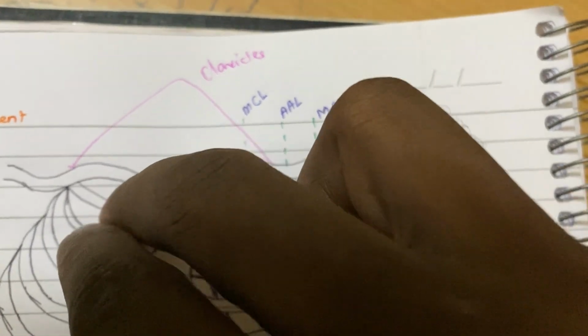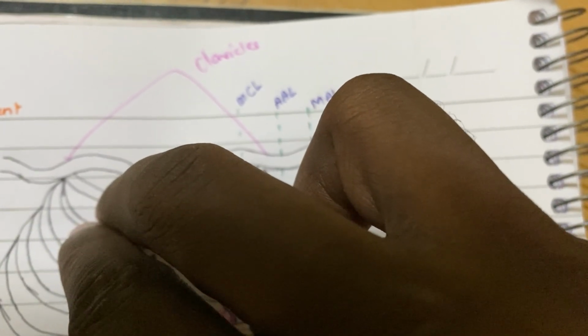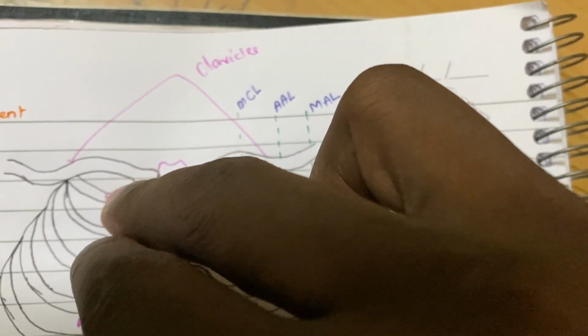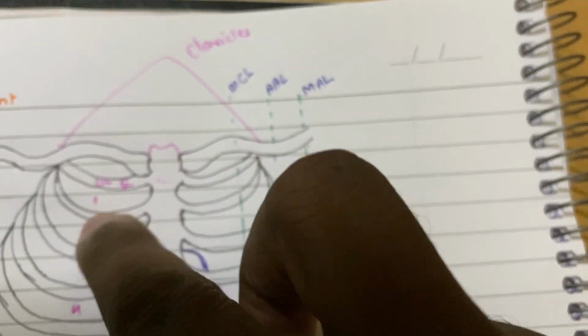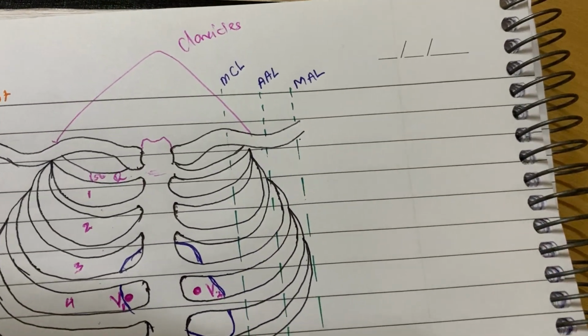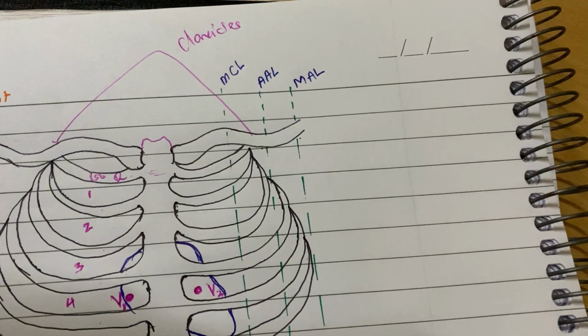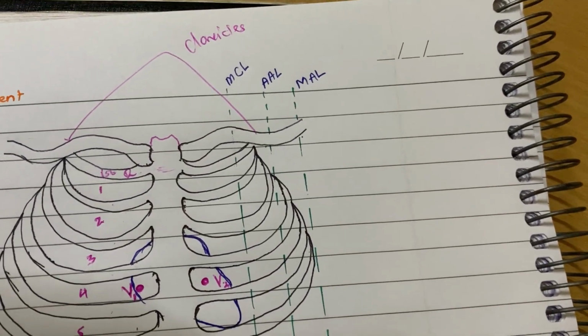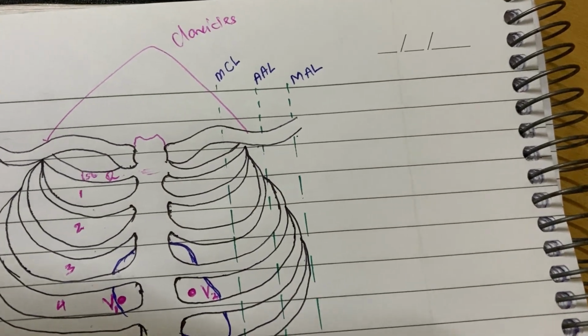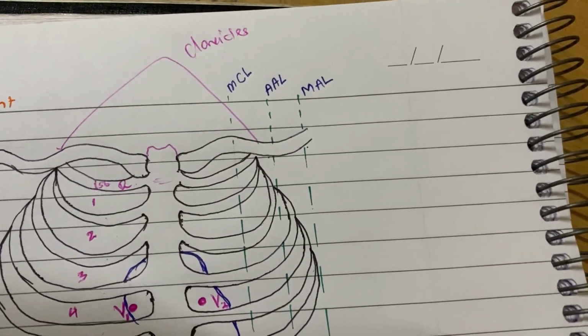First, you find a bony prominence, the second rib; you go below, no bone, that is the second space, then 3, 4, 5, 6. You have to count it. Proper placement matters. If you don't place them well, then the ECG waveforms will not be correct, and it will lead to wrong interpretation of the ECG. We don't want that.